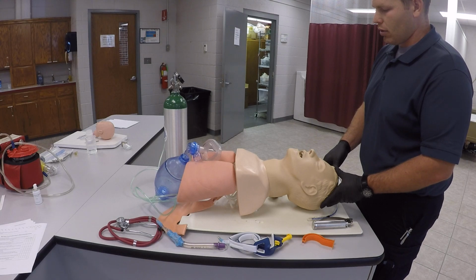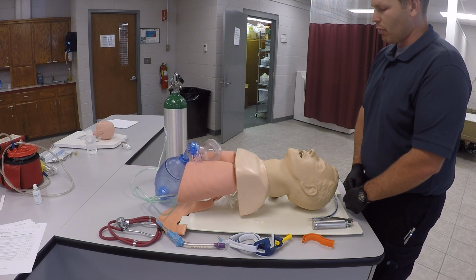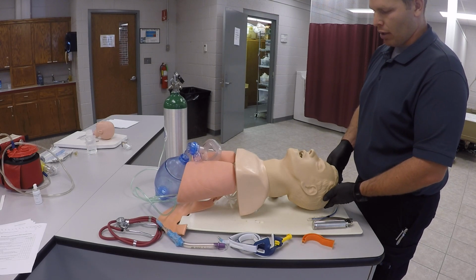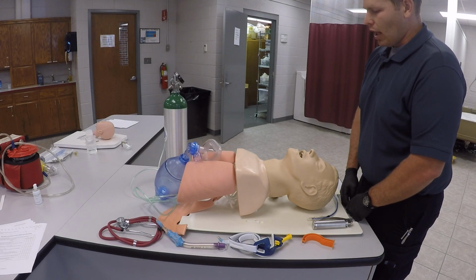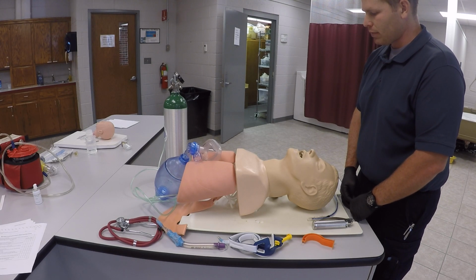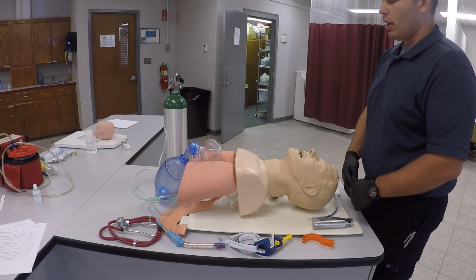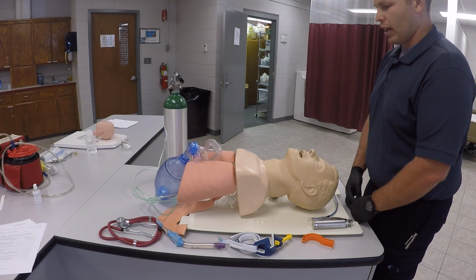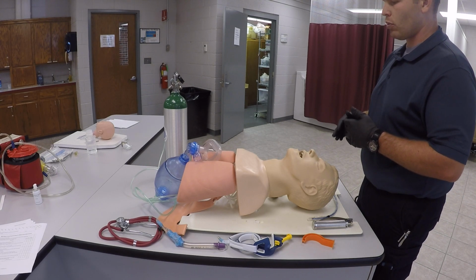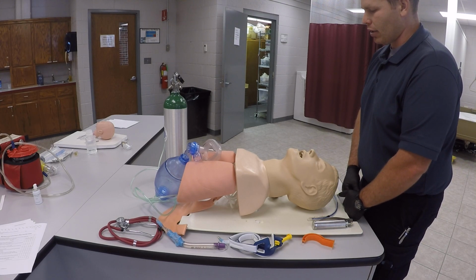The next thing we're going to do is inquire about any allergies the patient may have and talk to them about any previous reactions they might have had. We're going to explain to the patient the medications that we're going to give them and the reasoning behind giving these medications. Then we're going to make sure we have clear roles defined with our partner: one of them is going to be doing just med administration, one of them is going to be doing ventilations, and make sure they are clearly assigned to those things.